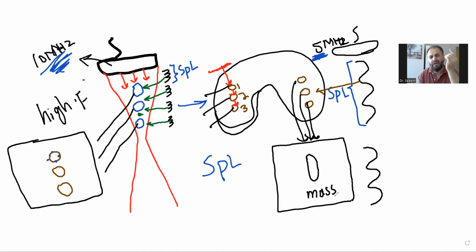It's a tumor, it's a nodule, whatever it is, but it will tell you there is one unusual structure seen on one of the lobes of the thyroid tissue, because you're using the mistaken probe with low frequency. And why am I using the wrong probe? Because I know both of them are 3 cycles, this is 3 cycles, this is 3 cycles. But the problem is that with a low frequency transducer, the pulses are longer.